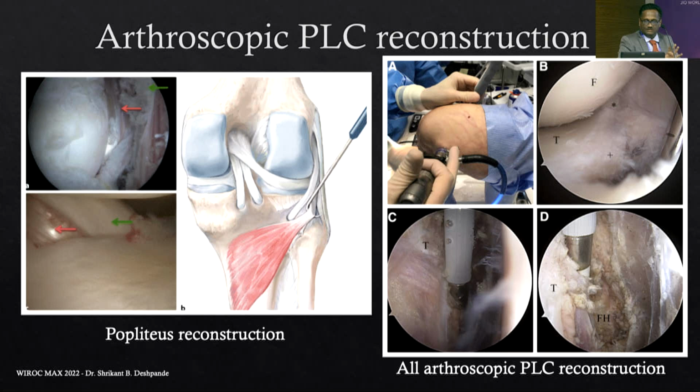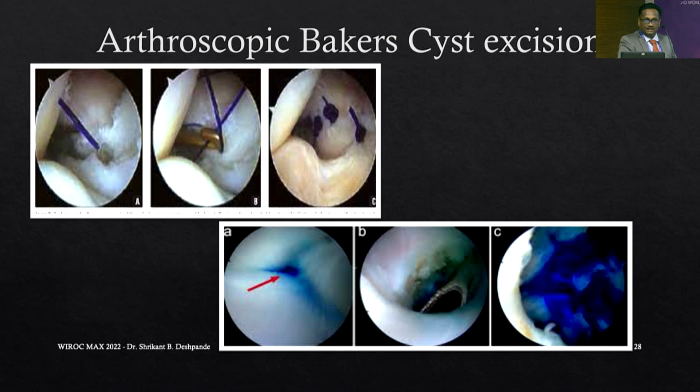I haven't got any experience in that, but I have copied these images from the net. I will tell you clearly. And arthroscopic Baker cyst excision. You can inject the methylene blue dye in the cyst, and where it leaks, Dr. Bancha has shown it in the previous case, I think so. That is a very nice technique. I have done 2 or 3 cases.